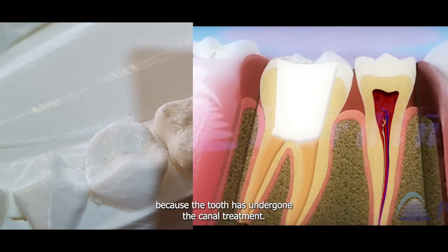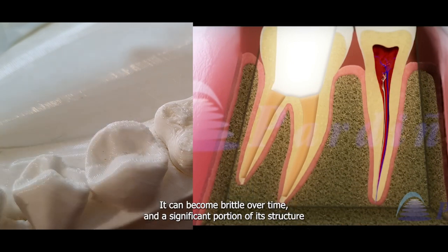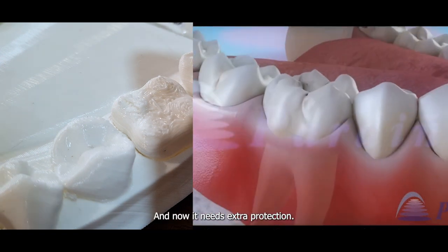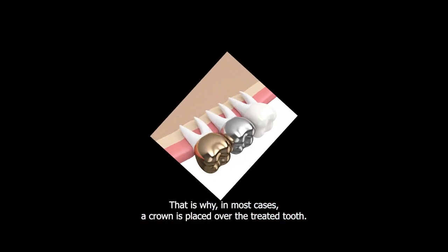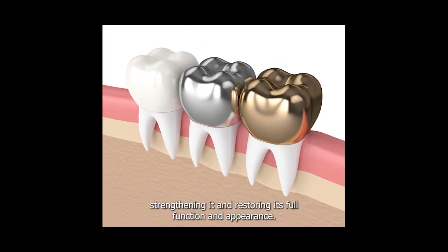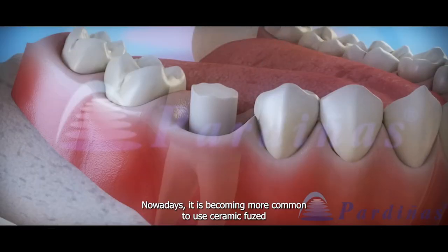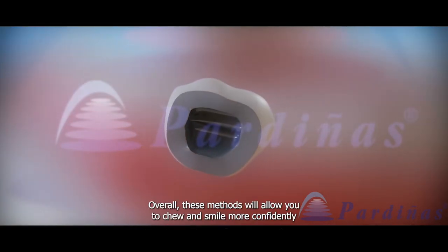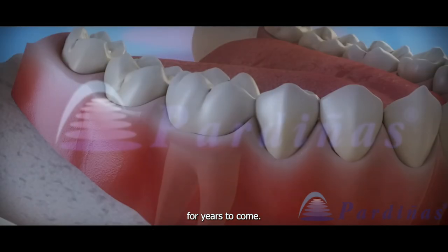Because the tooth has undergone the canal treatment, it can become brittle over time, and a significant portion of its structure may have been taken away due to decay, so now it needs extra protection. That is why in most cases a crown is placed over the treated tooth. This acts like a cap, strengthening it and restoring its full function and appearance. Nowadays, it is becoming more common to use ceramic fused to a metal crown to restore the tooth to its original color. Overall, these methods will allow you to chew and smile more confidently for years to come.